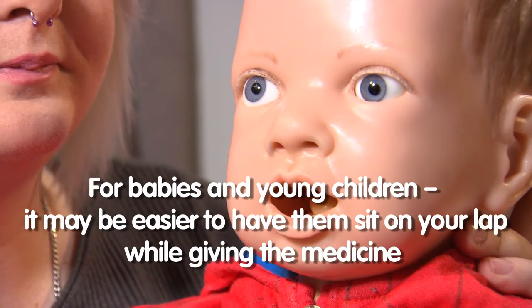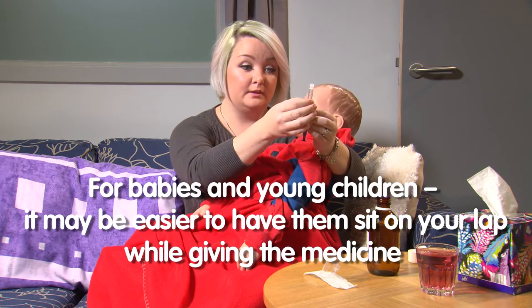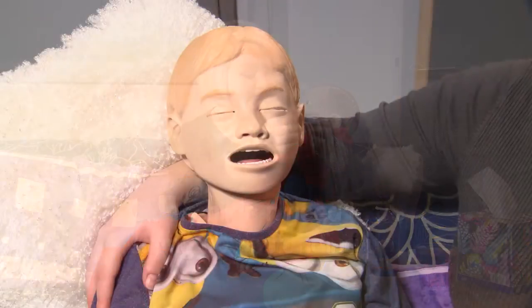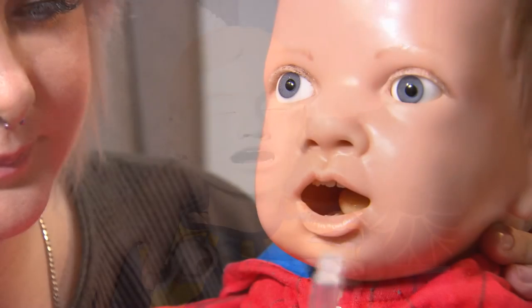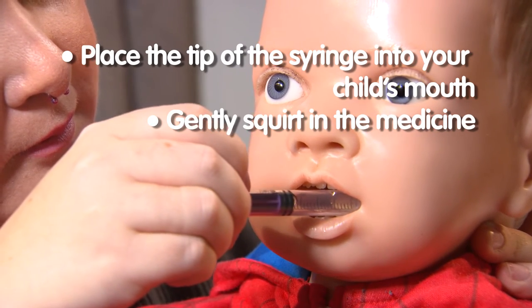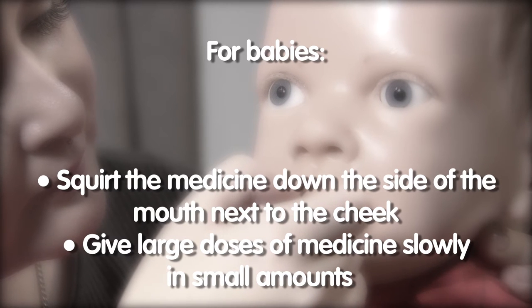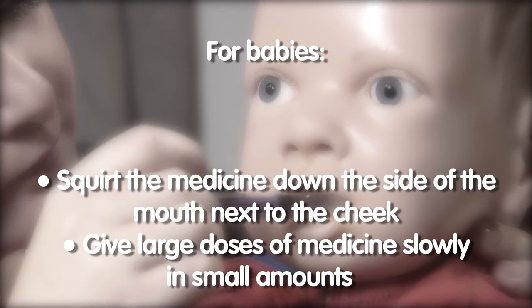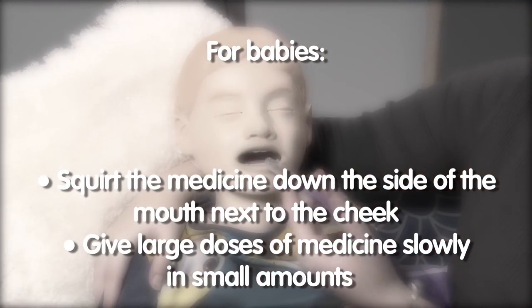For babies and young children it is often easier to have them sitting on your lap so that you can support them while you are giving the medicine. Older children should be sitting or standing up. Place the tip of the syringe in your child's mouth and gently squirt in the medicine. For babies it is often best to squirt the medicine down the side of the mouth next to the cheek so they do not choke. If you need to give a large amount of medicine then it is best to give it slowly in small amounts.